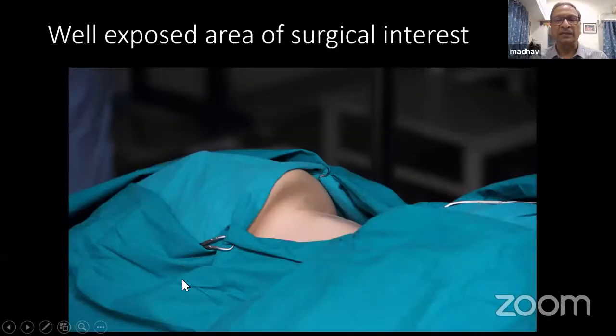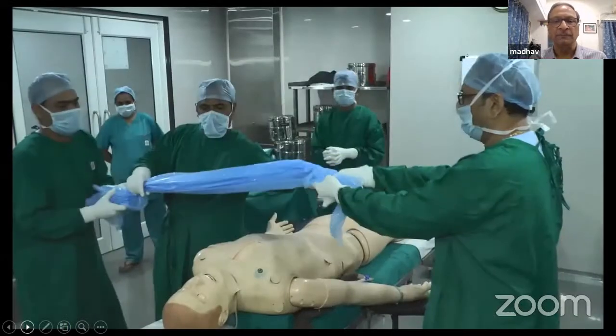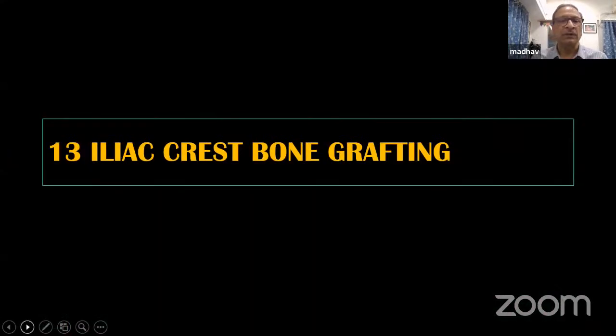Yeah, so that is the area which you can see, wherein you operate on the anterior cervical area, whatever, either excision of the disc, plating, bone grafting, fusion, all these surgeries are performed from this small incision. Okay, now we go for the iliac crest bone grafting.